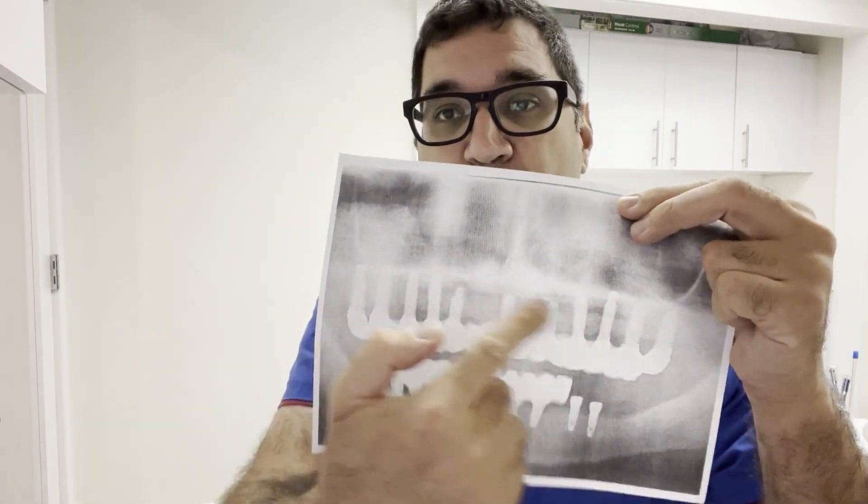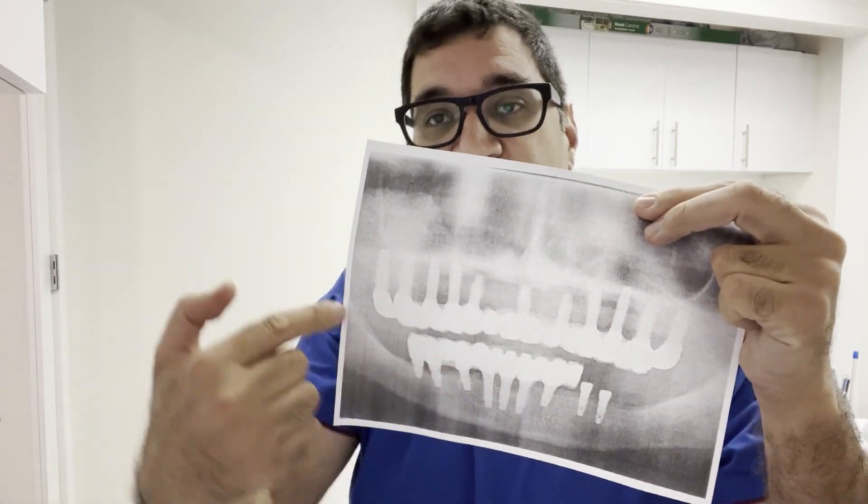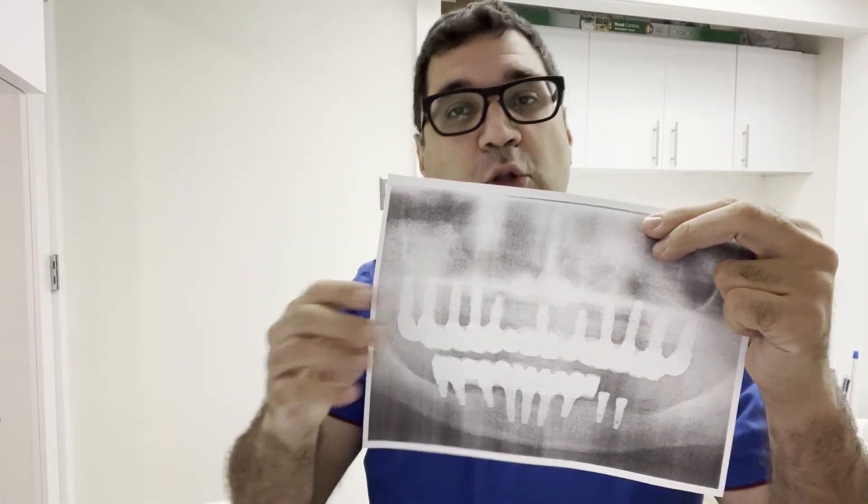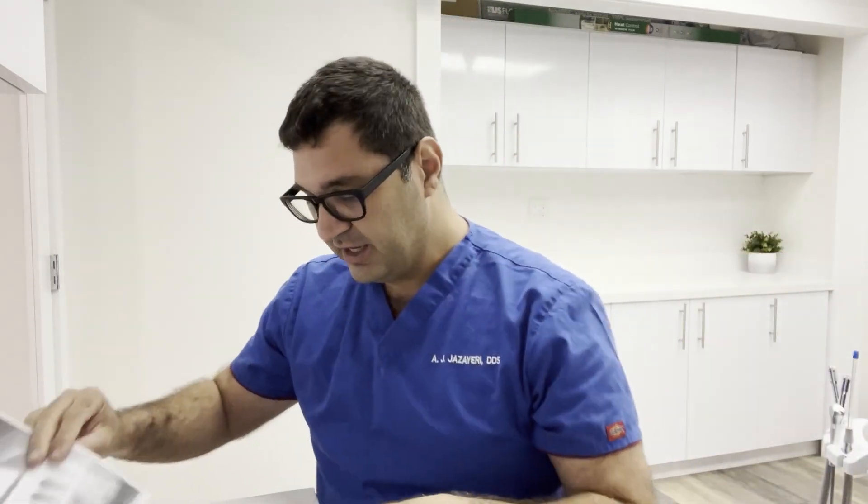Full mouth dental implants is one of two ways to replace all of your missing teeth. The other one is all-on-four implants — I have other videos that discuss that. Full mouth dental implants is a case like this, where you have a whole bunch of implants and a whole bunch of crowns and bridges on top of them, replacing every single one of your teeth in your mouth.